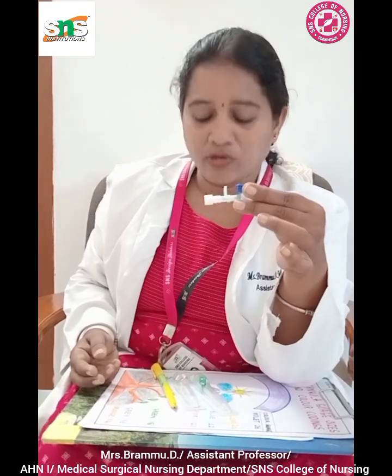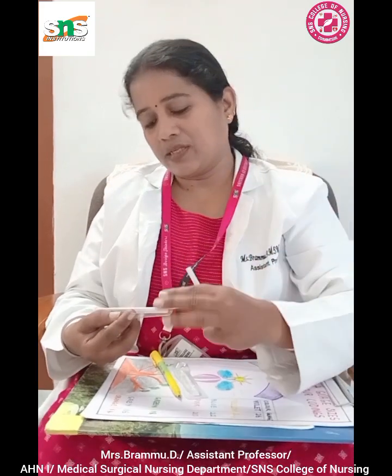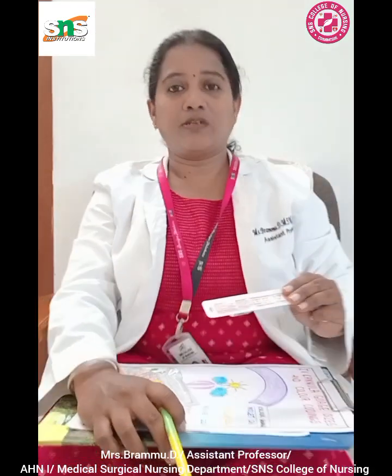So we, the nurses, have to check whether the valve is tight, or whether any seal or the valve is missing. Then it shows that the device is defective, and better you report it to your seniors and use a new one, right? And while reporting, see that you take out the batch number of that particular item. For example, if you find any defect, you will have the batch number here on the IV cannula. The batch number must be reported to the nursing superintendent or the higher authorities or the pharmacy manager.